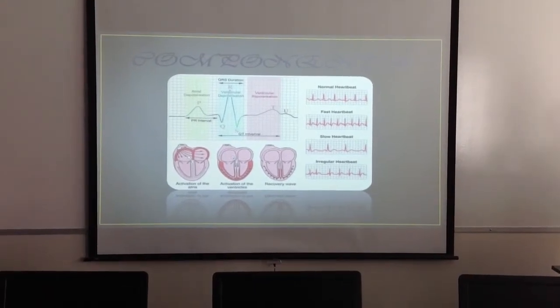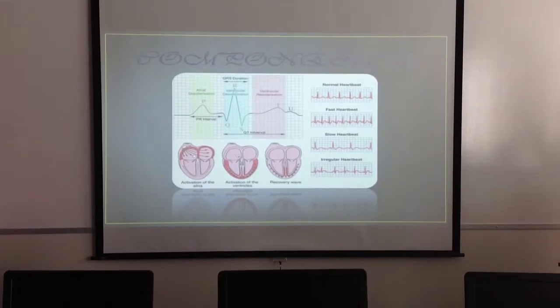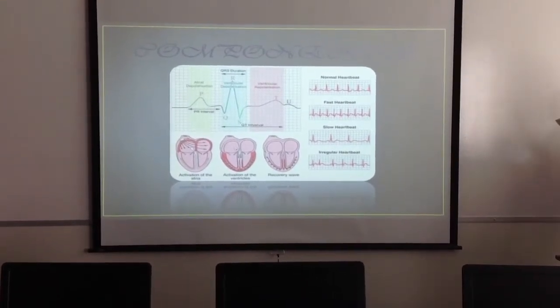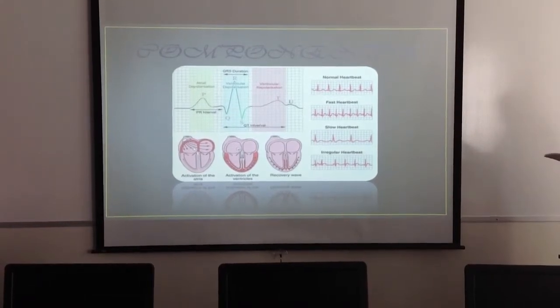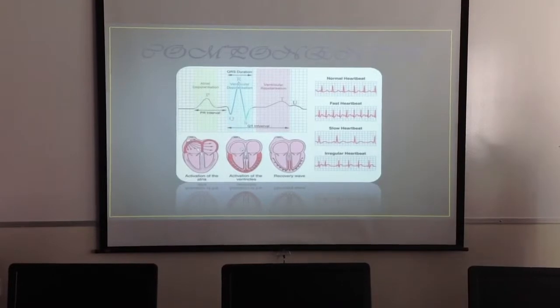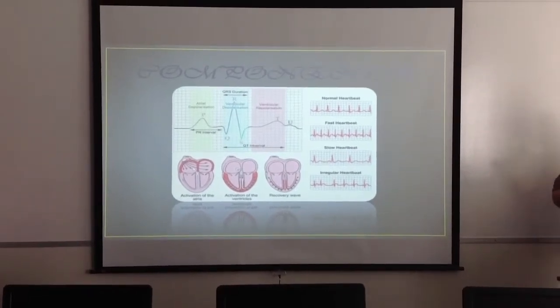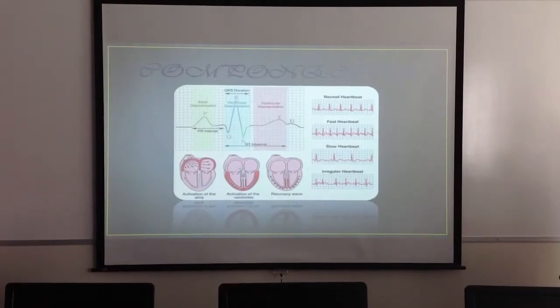The P wave acts in place of the normal atrium depolarization, which ensues when both left and right atria, upper heart chambers, which receive blood flowing back to the heart from the other locations of the body, contract and pump blood to the ventricles, lower heart chambers, which pump blood from the heart back into the body.